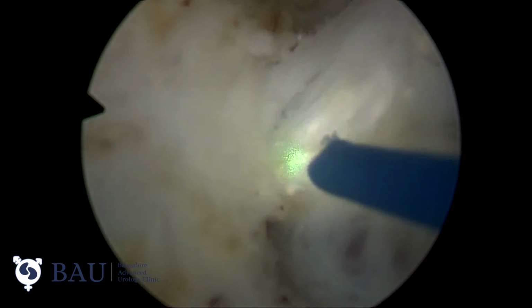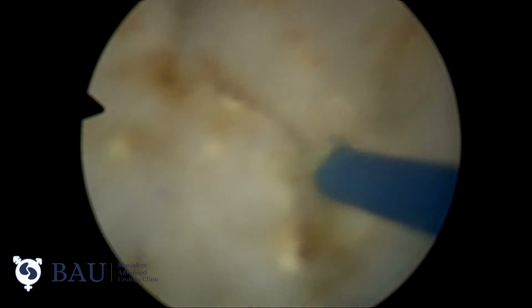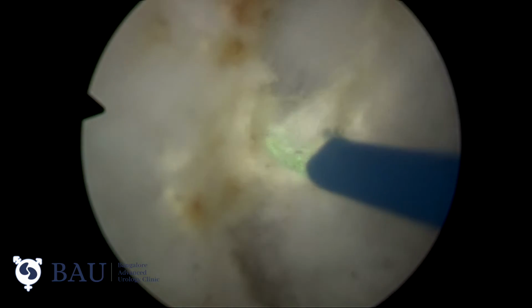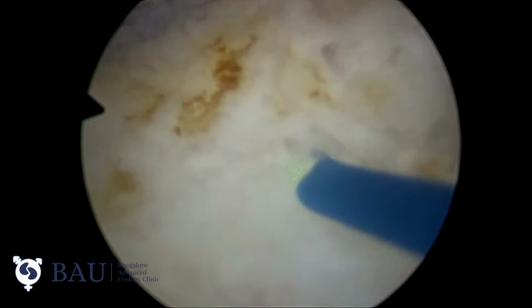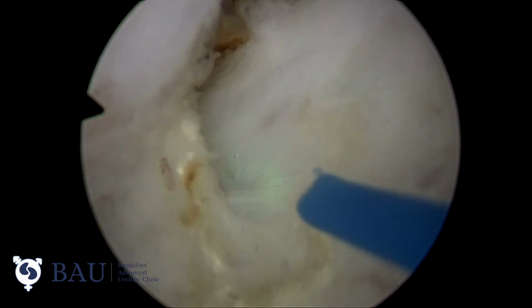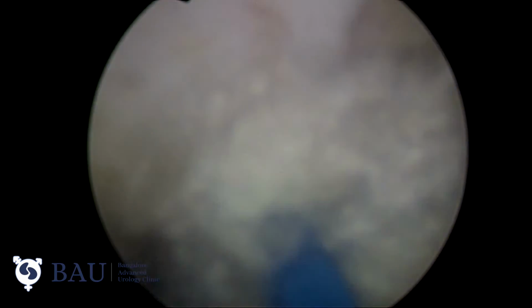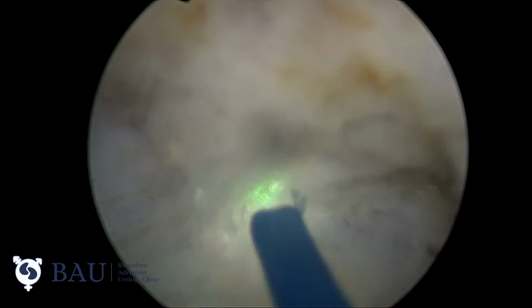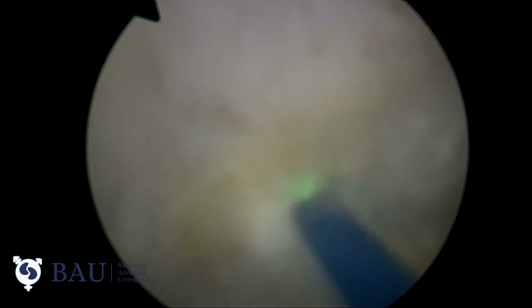This is the most difficult zone in posterior dissection. Here we may undermine the bladder and we can easily go behind the bladder. So for that reason, if you have already dissected the lateral part, here we have to just connect both the dissection lines.